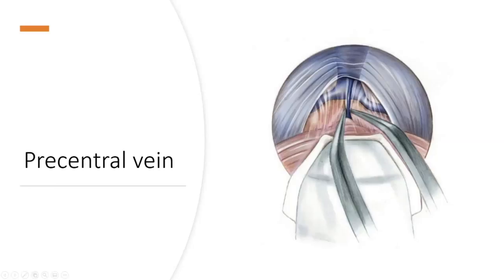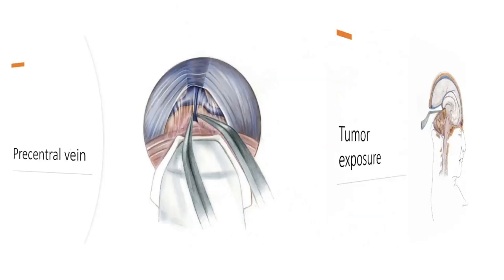There are many tributaries to the precentral vein, and this vein should be cauterized and divided in order to gain access a little bit deeper. Finally, you have tumor exposure.